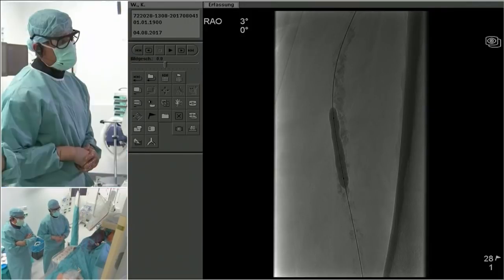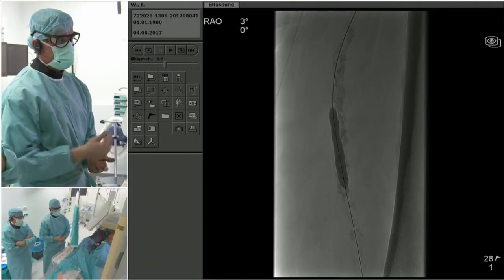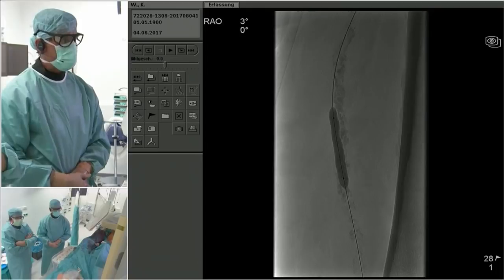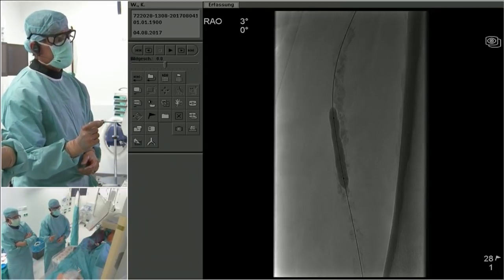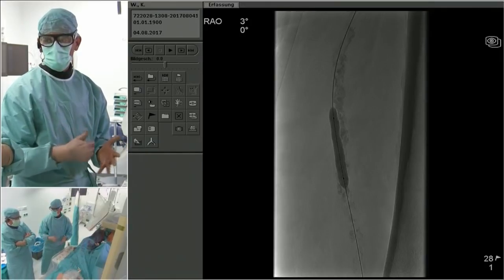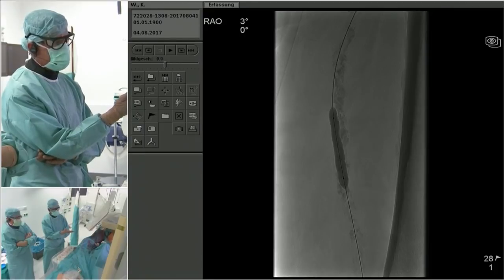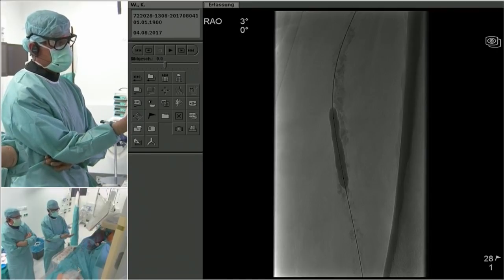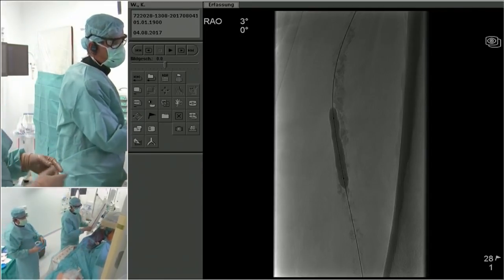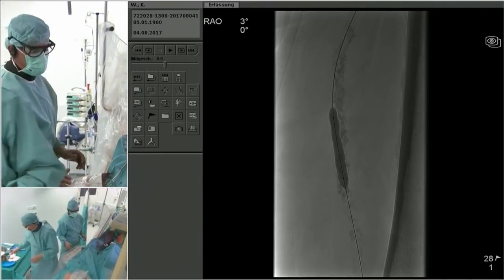But if I cannot open the balloon here, not even a 5, it tells me it will be extremely difficult to properly prepare the artery. So either you really go now directly to a short, maybe 7 or 20 millimeter balloon to prepare for a 5.5 Supera. And you can see here, as you said, maybe the plug will stay as it is, and the balloon will open to the other side, which is not diseased, and then you have the perforation. So this is something which, when I see this here, makes me think of the crack and pave technique.